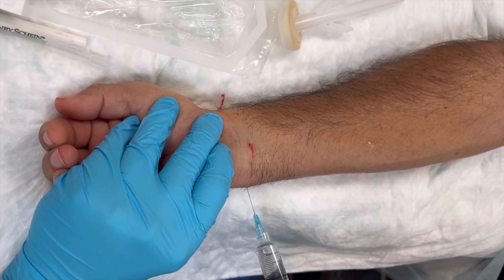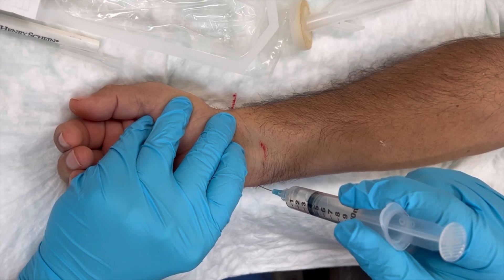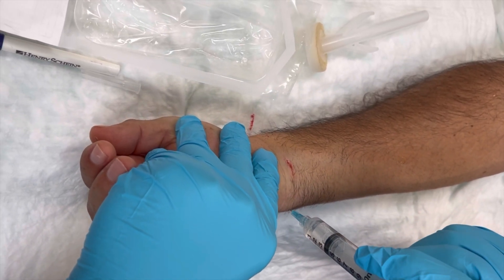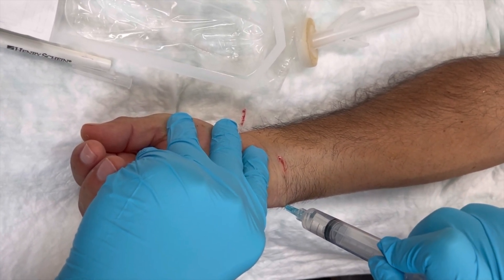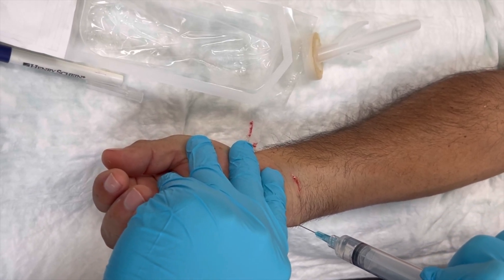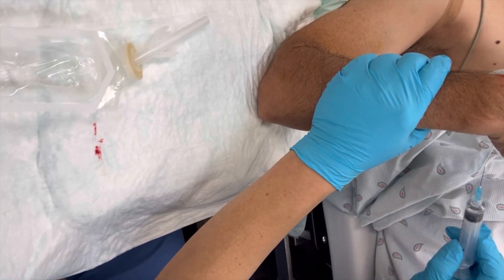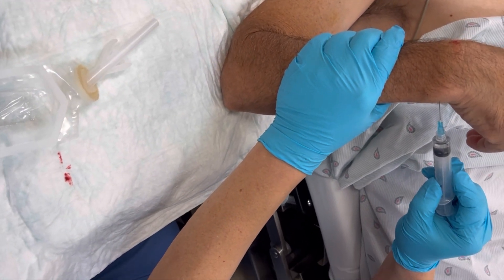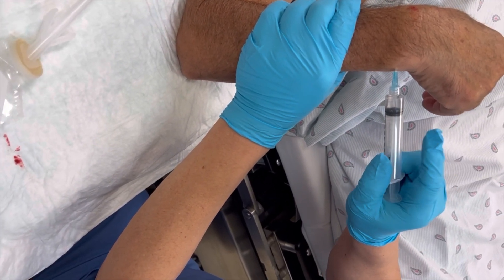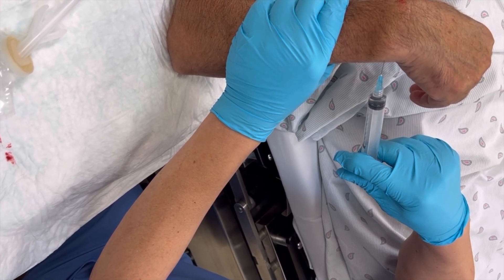Then withdraw the needle and redirect to the dorsal part of the ulnar nerve — the dorsal aspect. Inject, and also inject towards the midline. Inject and withdraw the needle.